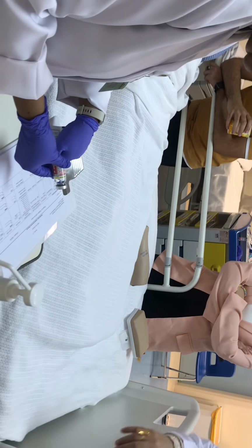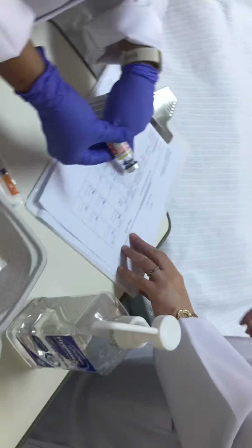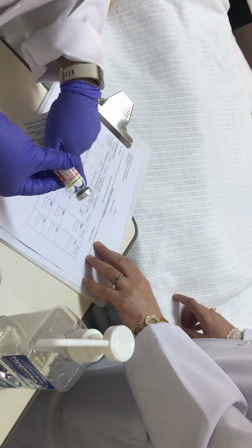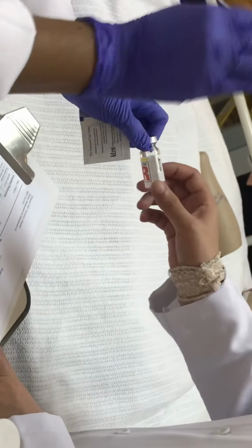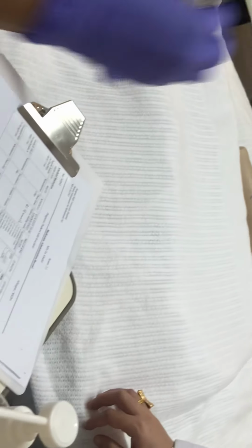So we are doing regular insulin 100 units per 1 ml and the patient's sugar level is 18. That's why I'm giving 10 units. Yeah. Okay, and it's not expired. All 4 things each time you are doing. Okay, second check is over.